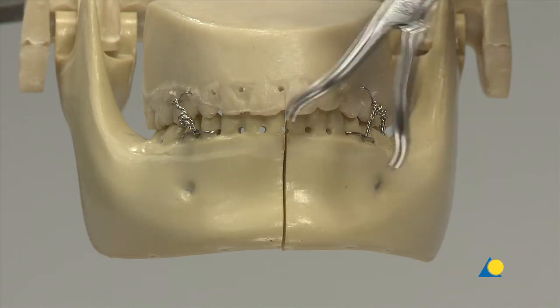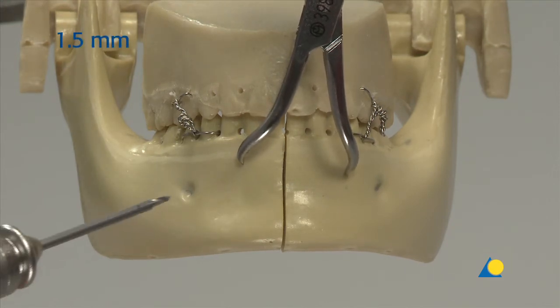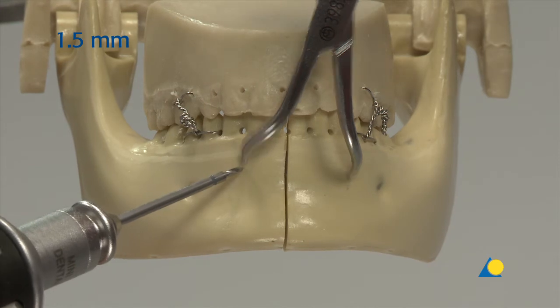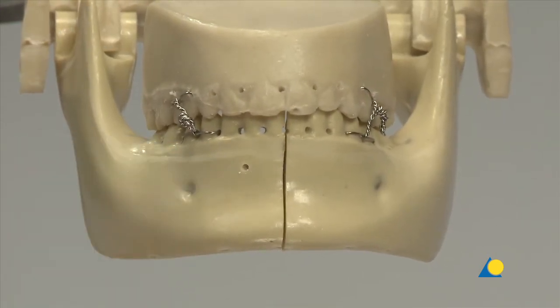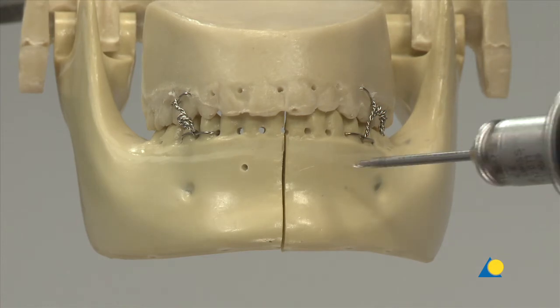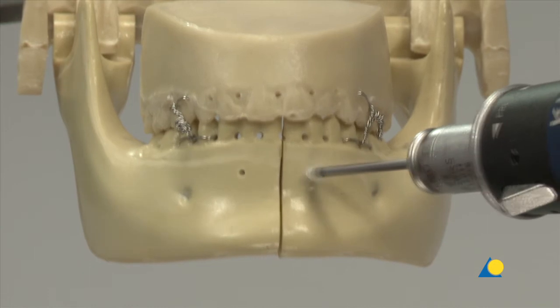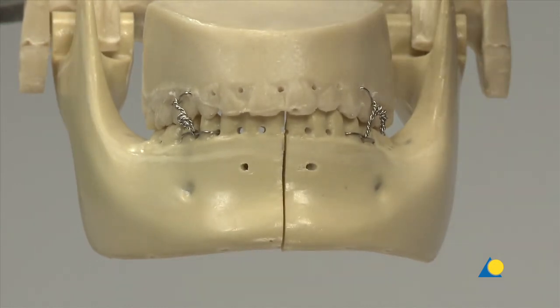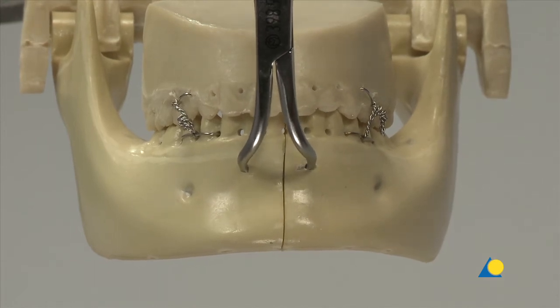The model requires two 1.5 mm monocortical holes to be drilled at the superior border on either side of the fracture to help when placing the reduction forceps. The line connecting the holes should be perpendicular to the line of the fracture. In the clinical situation, caution should be taken not to harm the tooth roots. The mandible halves are manipulated until anatomic reduction is achieved.